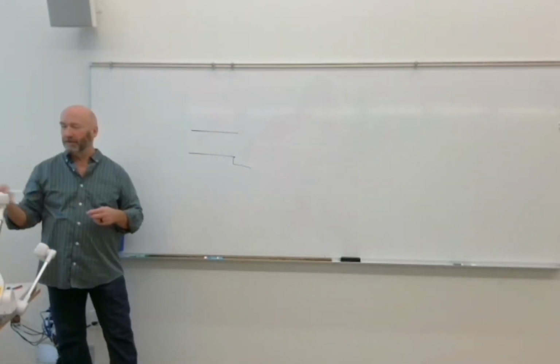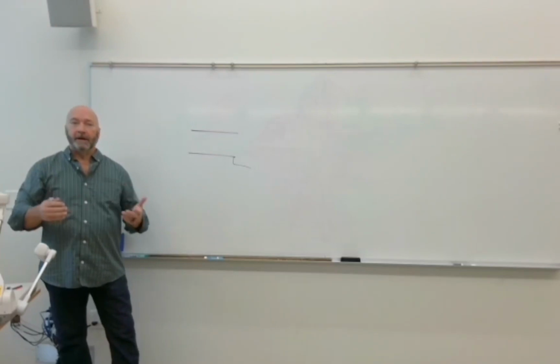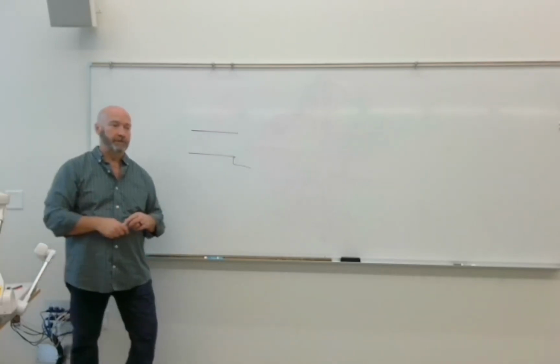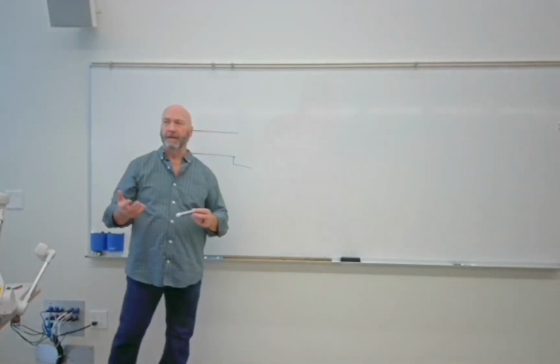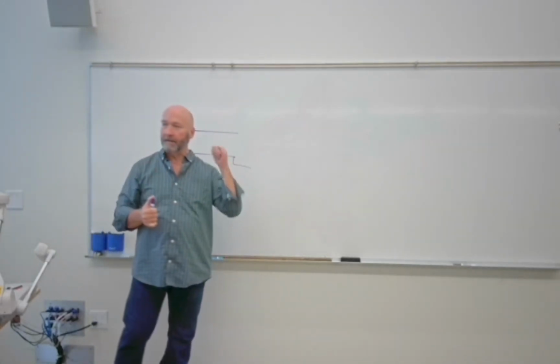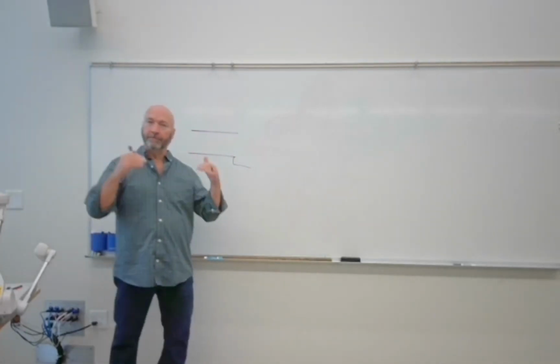The line voltage compensation circuit fixes our voltage before it goes into the autotransformer, because our voltage can fluctuate in a hospital. The book says by as much as 5%, could be more than that. A 5% change in kVp is enough to see some sort of noticeable difference on the image, at least when we used screens and films. In digital, not so much, but it's still not accurate, right? So if you make your exposure at the exact same time that the heater kicks on in the hospital, you're not going to get the kilovoltage you expected. Okay, so we have to fix it.